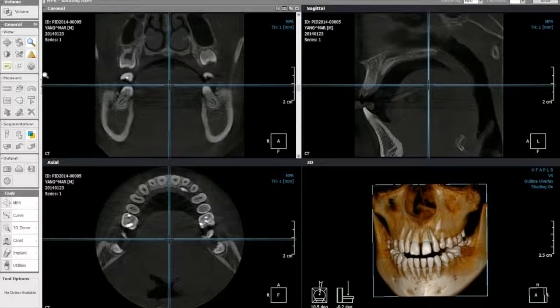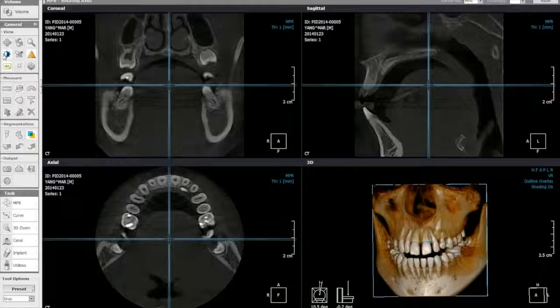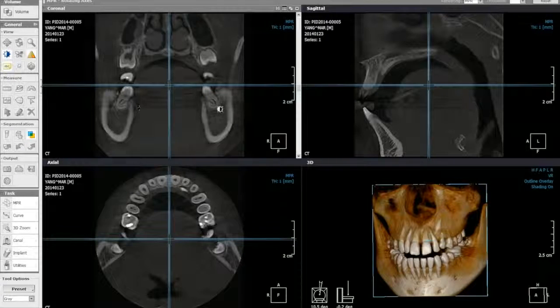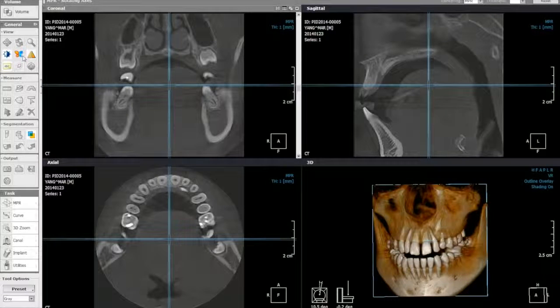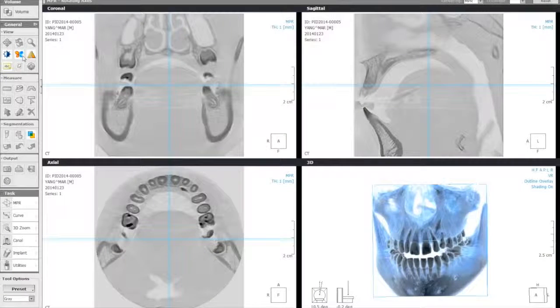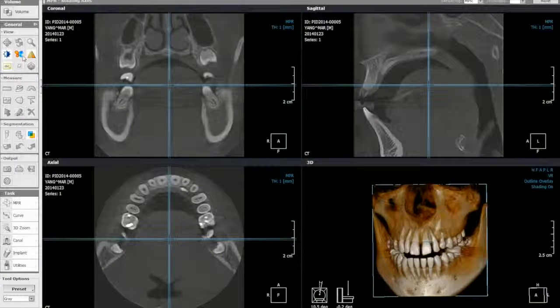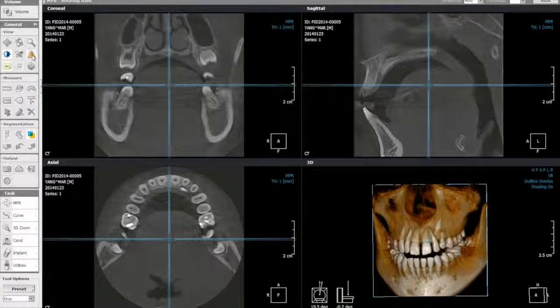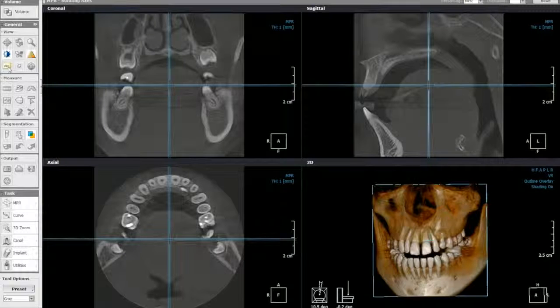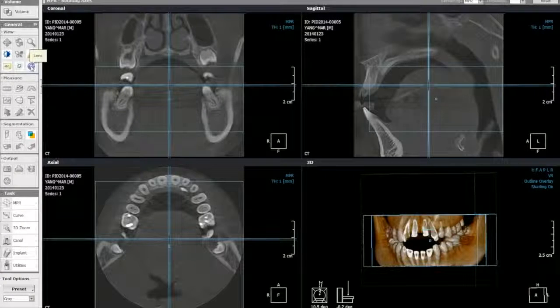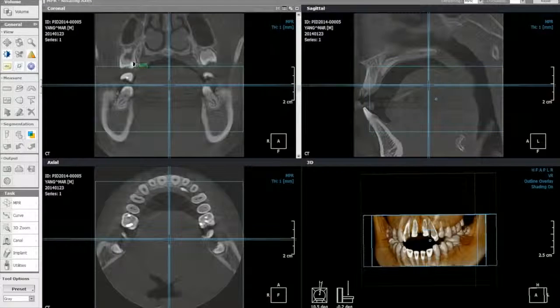You can switch to a brightness and contrast option, where a single left click allows you to change the brightness and contrast by moving up and down. You can invert the image, making whites black and blacks white — useful if there is particular anatomy or canals you might not be able to see in normal view. You also have a sharpen option, text overlay to show or hide patient information, and a lens to see density at points of interest.